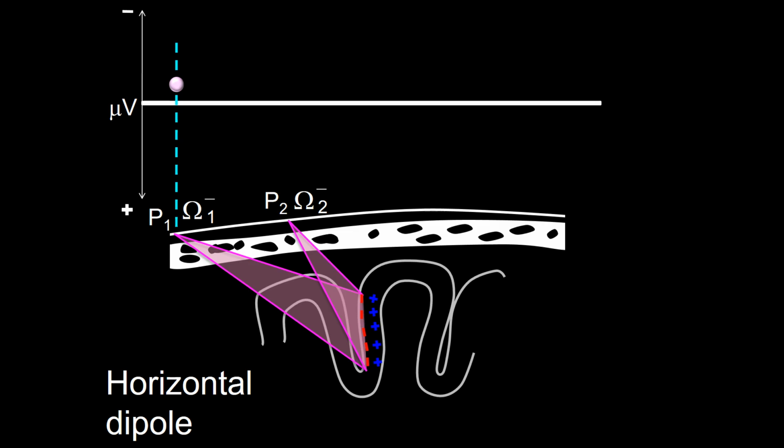I am going to do the same exercise with P2. Let's just say that the amplitude of P2 is bigger than the amplitude of P1 and that both are negative. This is so because on balance, the increase in amplitude resulting from a shorter distance is enough to compensate for the loss of amplitude due to a narrower angle. I will therefore place a point to reflect the increase in amplitude at the position corresponding to P2 in the voltage line.